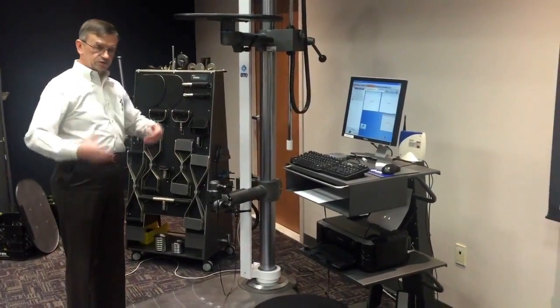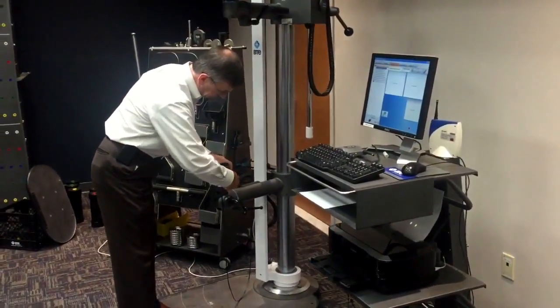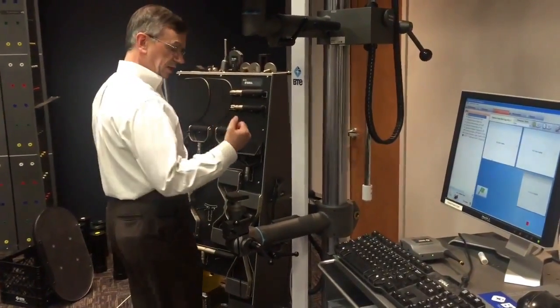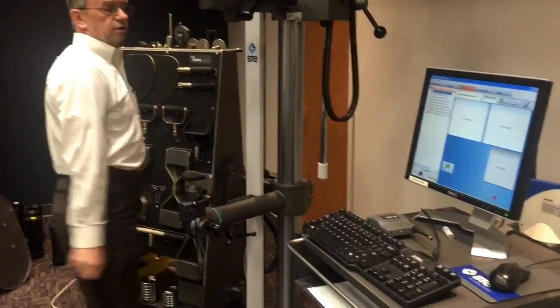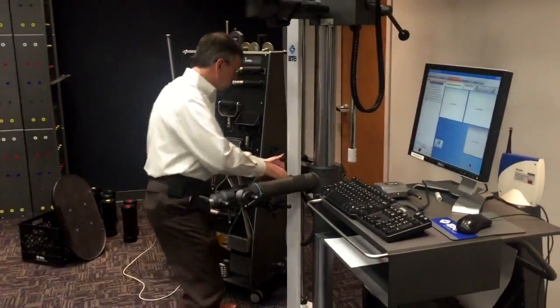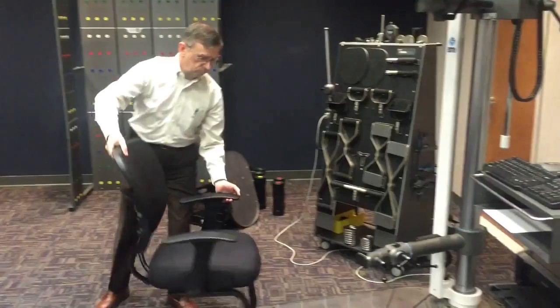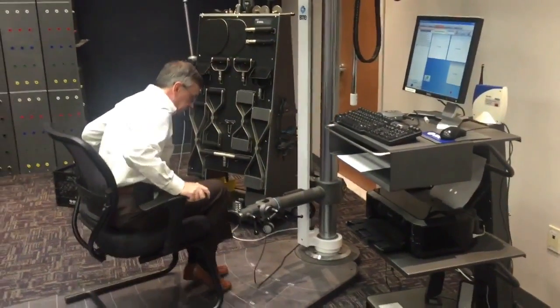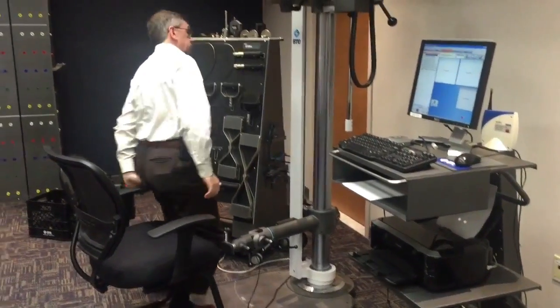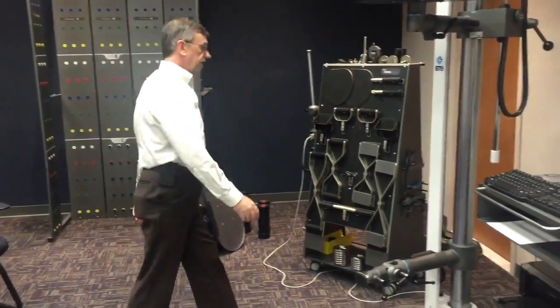Another opportunity to use the EvalTech system is for simple muscle testing. Instead of doing a manual muscle test, we can use a pad, adjust the height, and get the patient in position. If I wanted to measure elbow extension strength — rest here, push as hard as you can — strength is recorded. We can change this to other angles, lower this down, so that even if we want to test lower extremity, we put the chair into place, get the patient positioned, and they can be pushing against that, measuring extension strength. It doesn't have to be a complete functional capacity evaluation — it's a nice system for simple baseline strength measurements. And in a moment I'll show you how to also do range of motion testing.